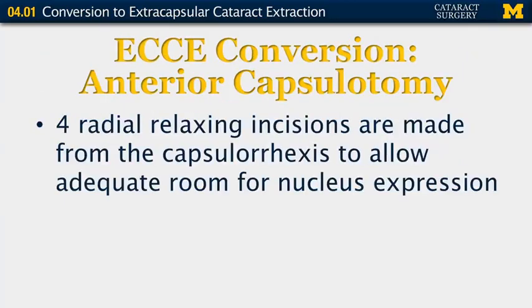If you've done a capsulorrhexis, you will now need to make those four radial relaxing incisions discussed earlier to allow adequate room for the nucleus to express, because it will not be able to express in whole from the small capsulorrhexis opening.